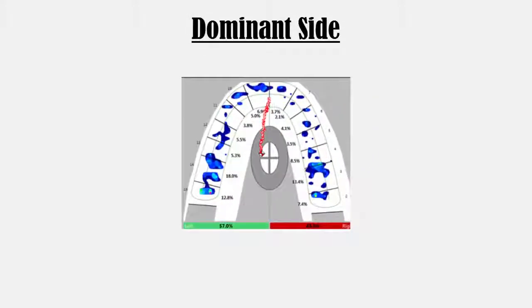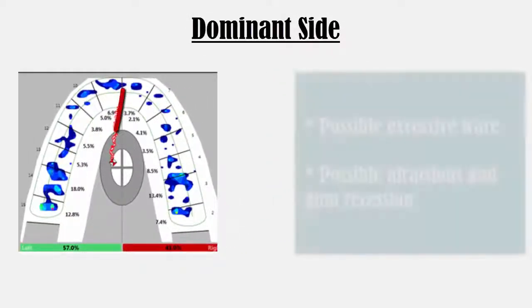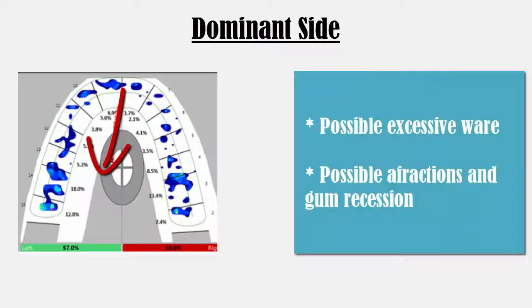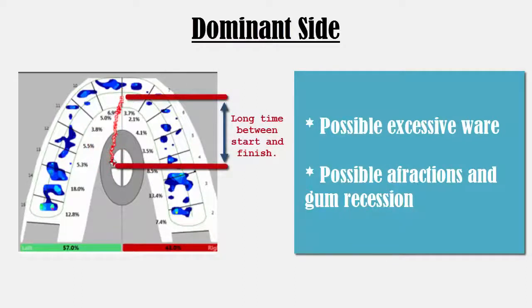The second example demonstrates a dominant left side. Notice how the center of force starts in the center then migrates towards the left posterior teeth. Also, a long trajectory suggests excessive time during closure.